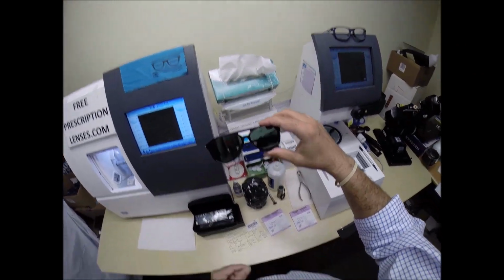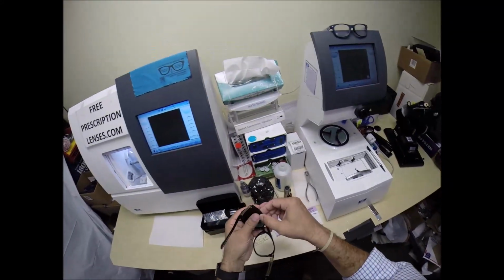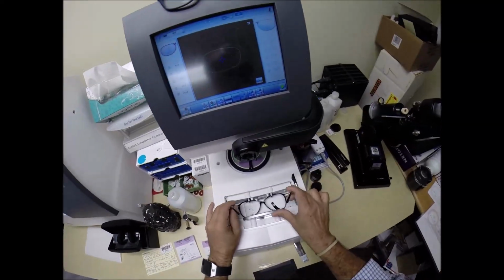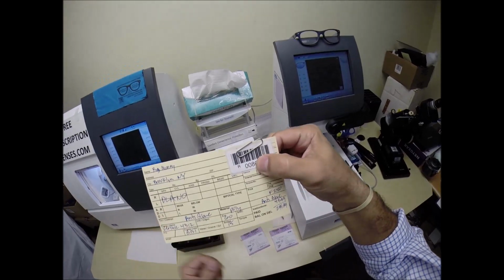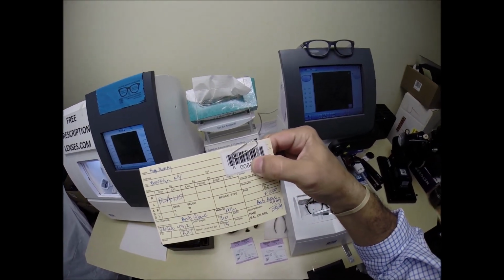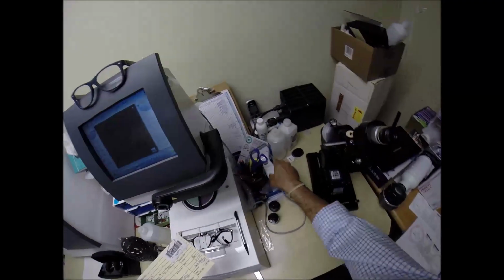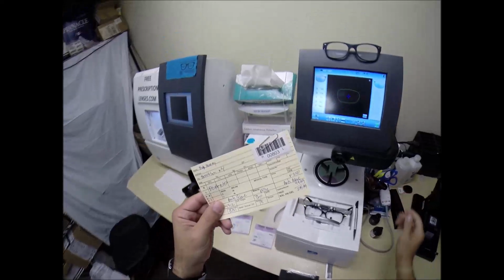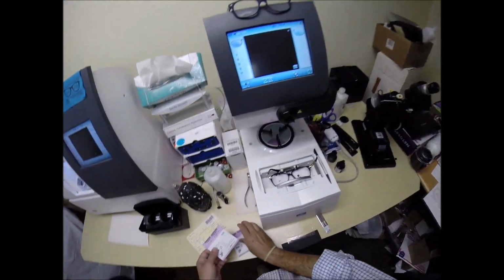And of course, big guys would love to wear these as prescription glasses, but what I'm going to do is pop out the original sunglass lenses, and we're going to cut some clear, non-prescription fashion lenses to go in here. So I'm going to take your frame, put it in the tracing element of my blocker. I'm going to program the shape into the computer. You are Secret Agent 008. You've surpassed 007. You are 00803. So years from now, should you ever want to get prescription lenses in here, I've got it programmed into the computer, and I can send you prescription lenses right to your home.